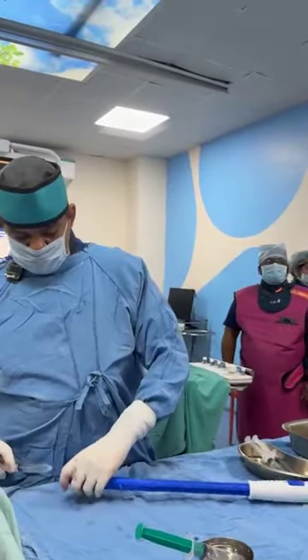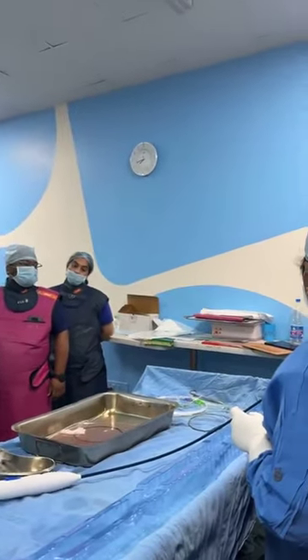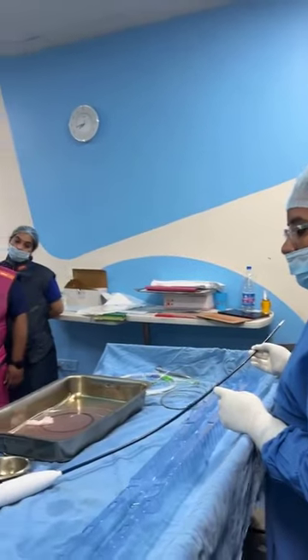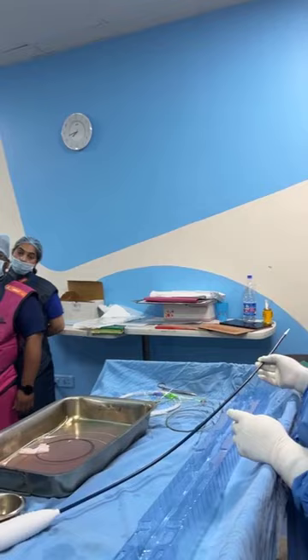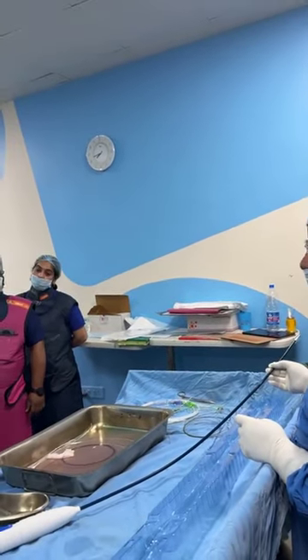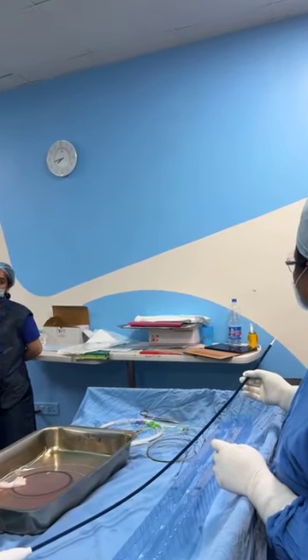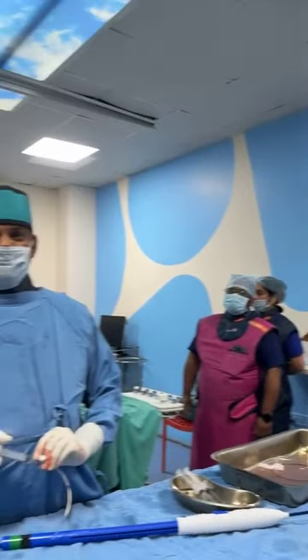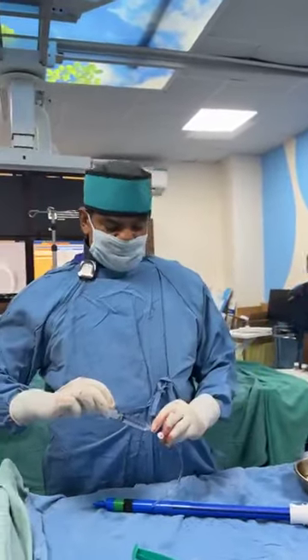Up. Side put 20 cc. Easy to inject. If you are injecting with the 10 cc it is easy to inject. Suction. And you use less plastic, right? Less plastic.